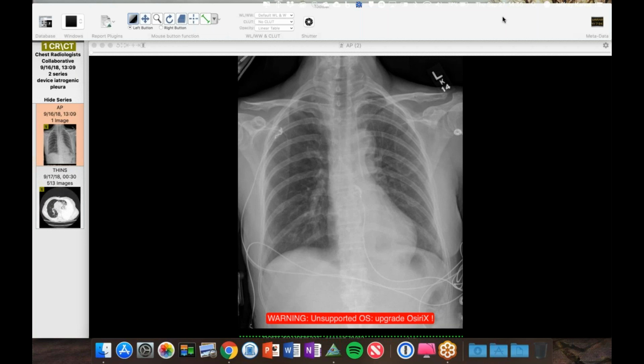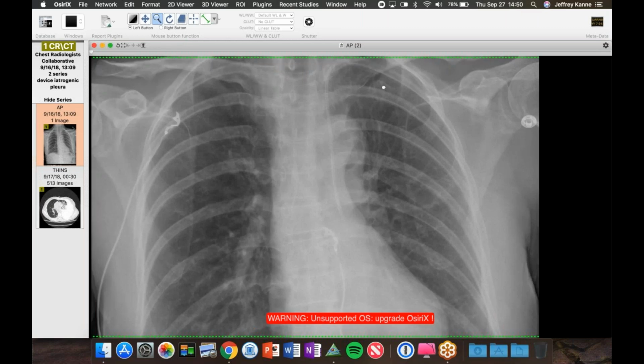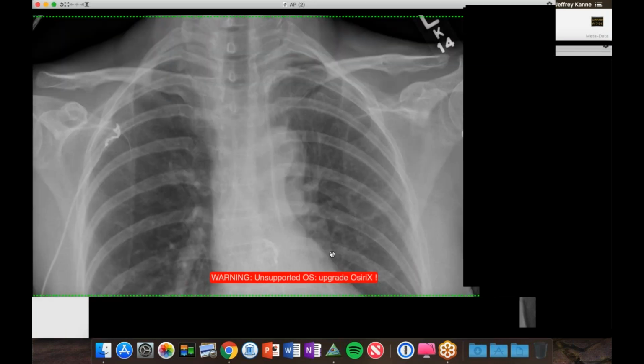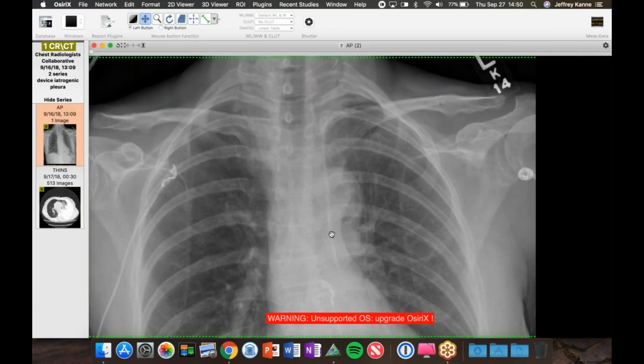So this was for line placement, and this was correctly reported on the outside as an unusual location for the central venous catheter. You can see that first of all, it's supposed to be a subclavian approach. It courses over the clavicle, which is abnormal. And then it also courses straight down, overlying the aortic arch, and then what would be maybe the descending aorta. And the outside radiologist correctly went back and ruled out any anomalous anatomy, such as a left SVC, which should be lateral to the aorta anyway, and said this could be an arterial line. But for whatever reason, we don't exactly know all the details.